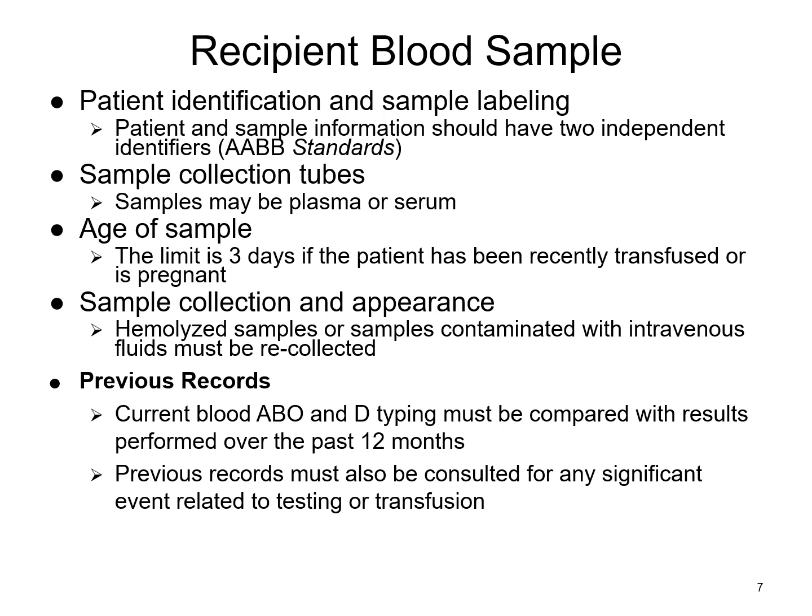If you're sending samples out to another facility for them to work up something, they may request serum as well as plasma. So whatever testing you're going to have to do, just make sure that you're aware so that you know what sample to send.